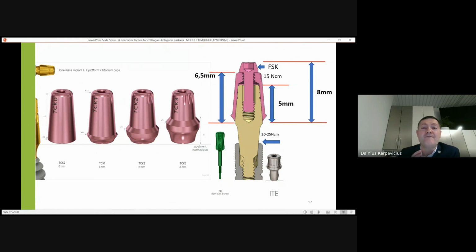These are extremely important for Conometric, because of manipulation in the mouth, since I myself do surgery and prosthetics as well. To understand all these features, what you can do in the mouth, all the manipulation and possibilities, I can tell you as a prosthetic specialist, it is a very important part of the Conometric crown.